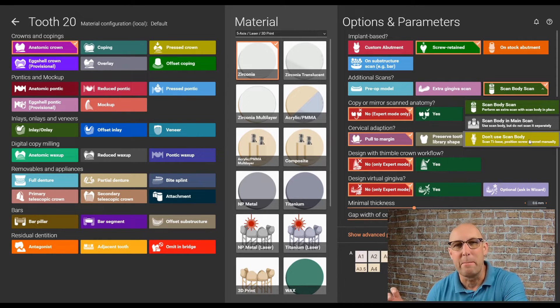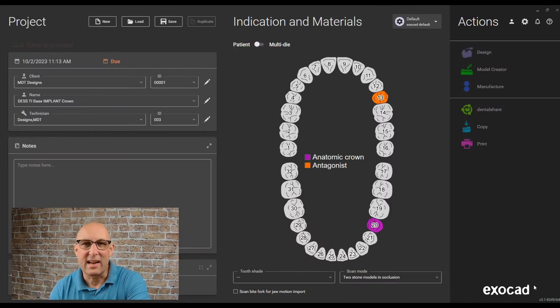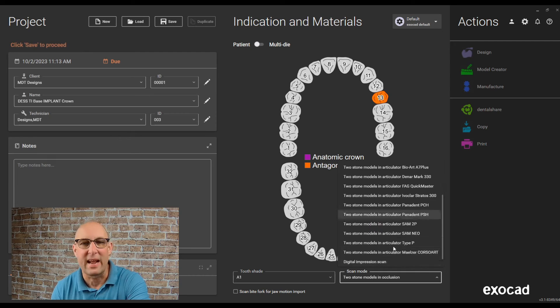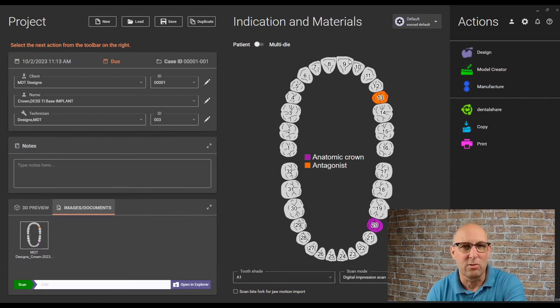If the scan body is embedded in the main scan, use the gray button. If you just scanned in the tie base, use the yellow button. After that, just click OK. Select a shade from the Shade menu, select Digital Impression — this is a digital impression with a scan flag in there. Hit Save and then we can go into the design.